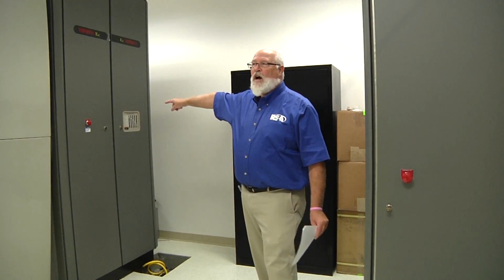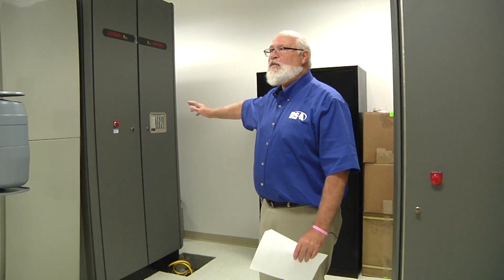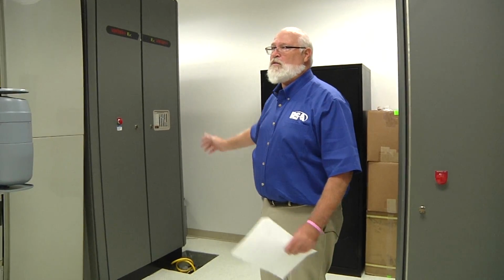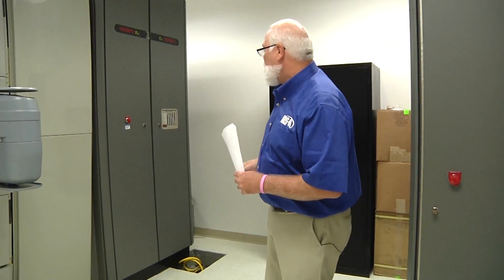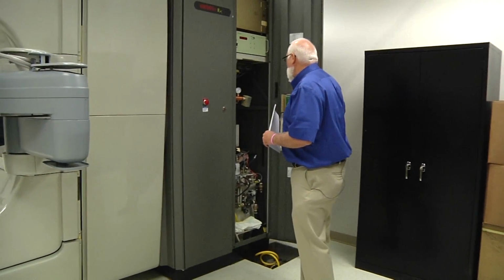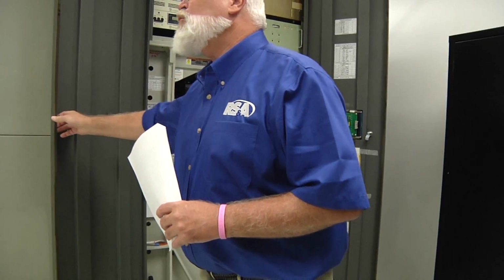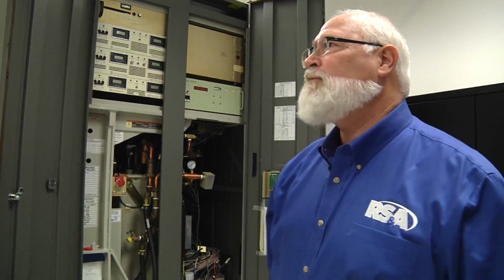And that's applying high voltage to your klystron, which is roughly 125,000 volts. That's just what it takes for that power tube to amplify your RF power. So on this system, this is where you will do your maintenance. You can come around here.